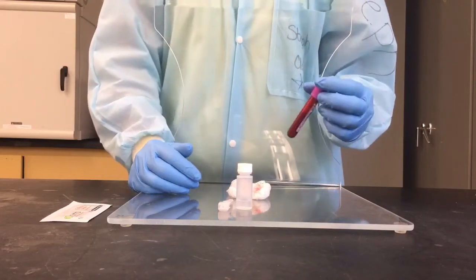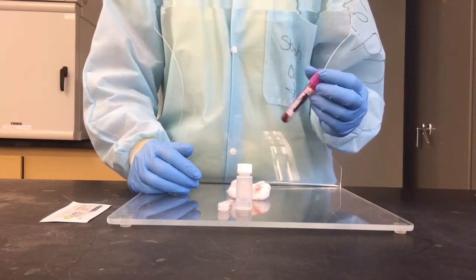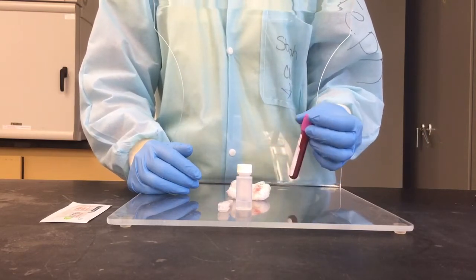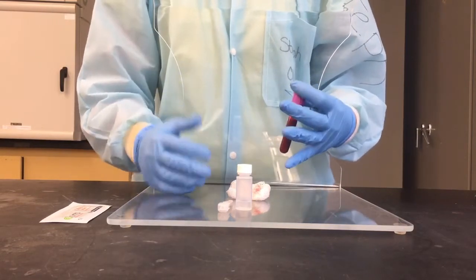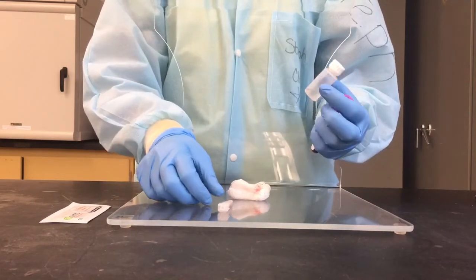All right, guys, so before you come in for lab this week, I wanted to give you a quick rundown of what the WBC procedure looks like, because there's a lot of stuff that you won't have really done before in lab. It's not really hard necessarily, but it's hard to explain without having a visual to go along with it. So we are going to use these things called the Leukocheck reservoirs.